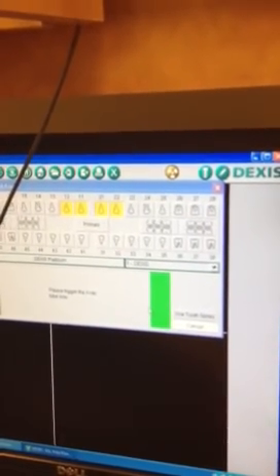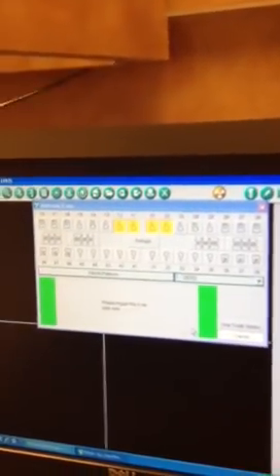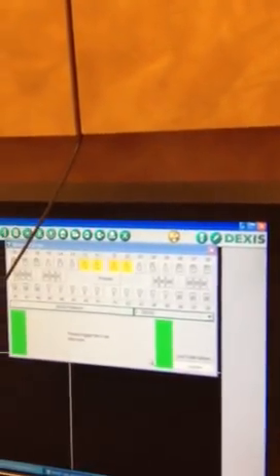Now it's green, so we know we can go ahead and expose. When we're looking at the long cone paralleling technique using the sensor, we want to make sure that we choose the right PA holder for the anterior. The blue is anterior, the yellow is posterior, and the red is bite wing — and you can do vertical or horizontal bite wing.